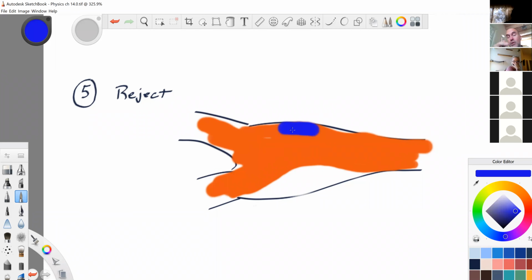If you show this to an attentive doctor, some doctors will not see this, but others will. They'll stop you and they'll say, all right, go back, see this patient again, and I want to see the entire bulb filled, because how do I know that that's not hypoechoic plaque in there?